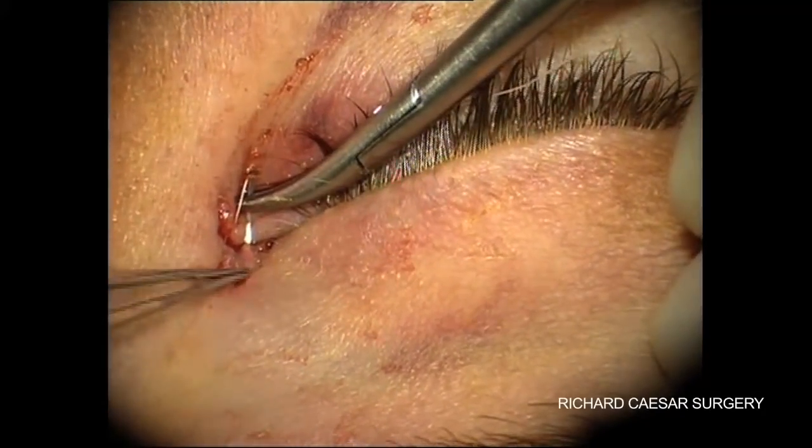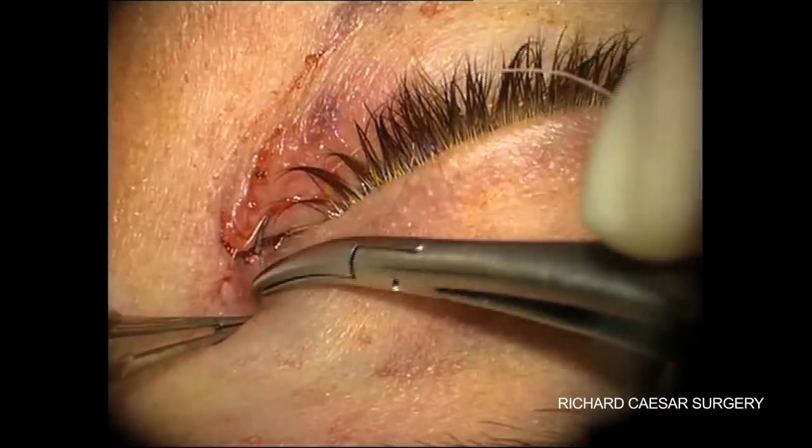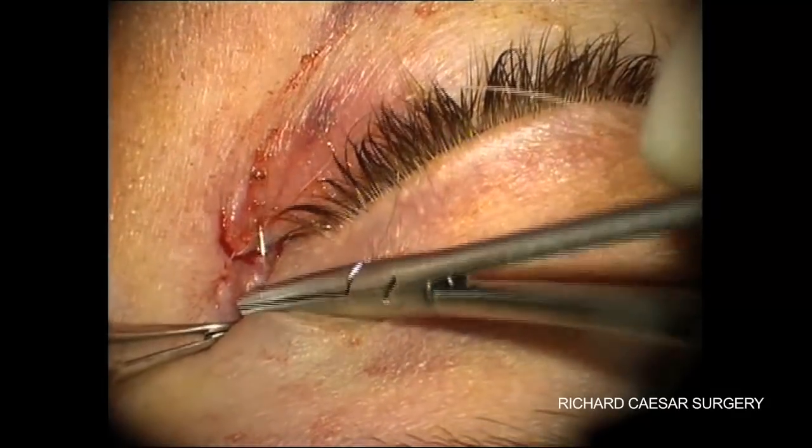The sutures here to the skin are 6-0 vicryl, which can be left to dissolve, but I normally remove at a week.